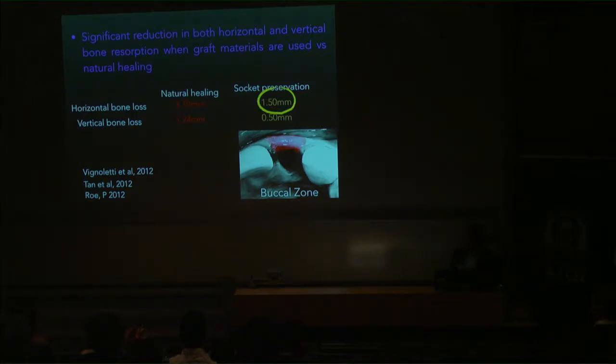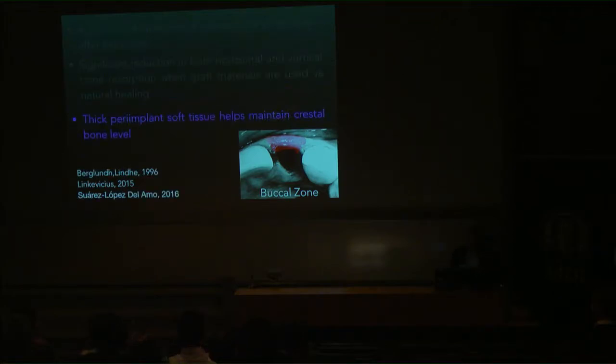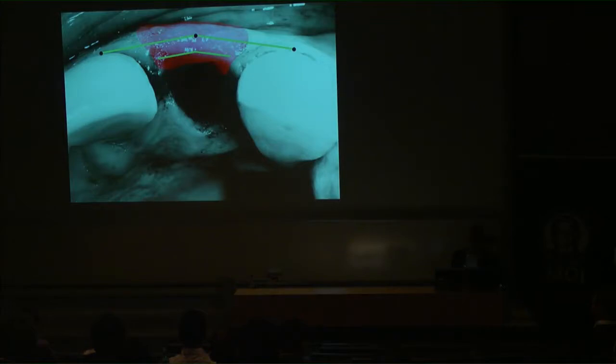Remember, there is still a measurable amount of horizontal bone loss even after socket preservation. The thicker peri-implant soft tissue seems to have a positive effect on the crestal bone level. An implant treatment guide has suggested that a safe zone for implant placement is within 1.5 millimeters lingual to the attachment line that connects the root surfaces of adjacent natural teeth.